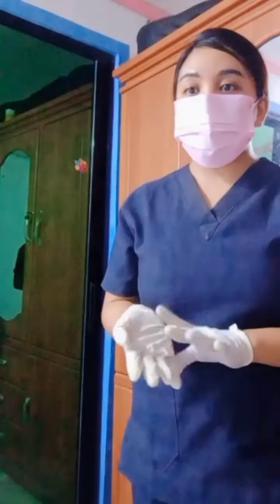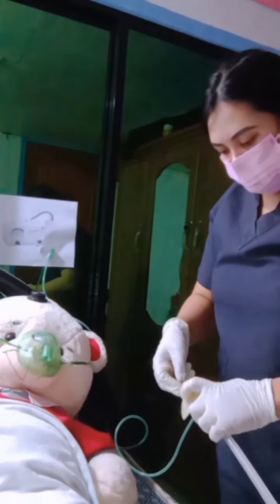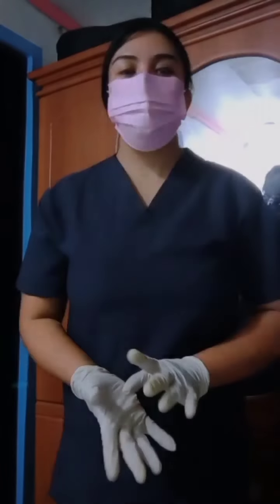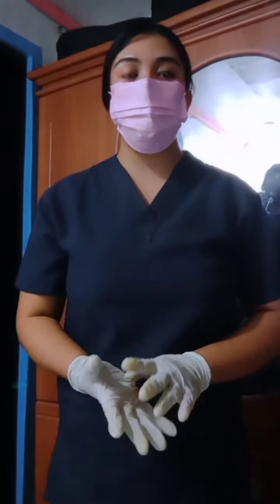Use your dominant hand to pick up the suction catheter without touching any non-sterile surface and use your non-dominant hand to pick up the connecting tubing. Attach the catheter to the tubing to make sure the equipment works properly. Suction a small amount of normal saline from the basin.